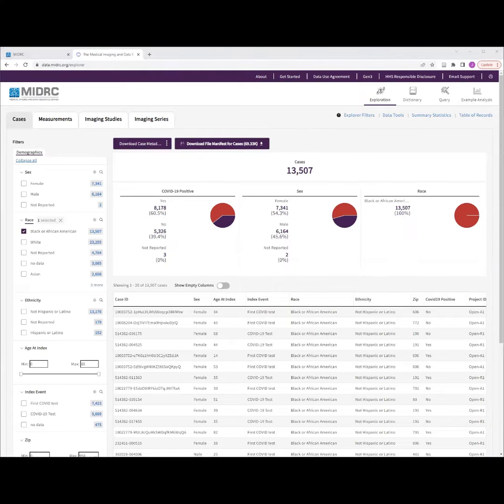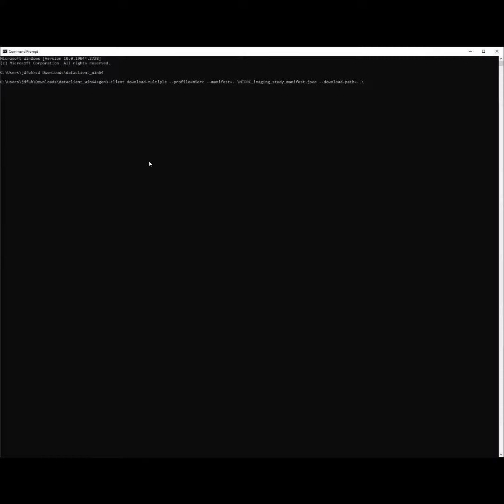Once you've opened a command prompt window, as shown, you must navigate to the location where you have saved the Gen3 client in a prerequisite step.